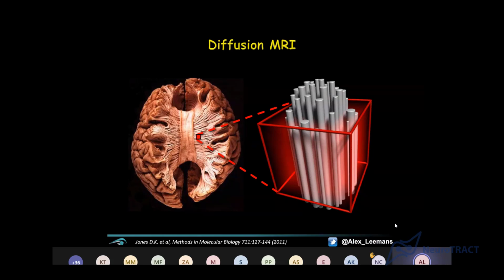So the cool thing is, conceptually, we could also look at diffusion in brain tissue, right? And how would that work in brain tissue? Well, as the image shows here, it's a Klinger dissection. We mostly have fibrous tissue in our brains, meaning that there are coherent highways. It's sketched over here. And it's not hard to imagine that within the brain, we also have anisotropic diffusion.